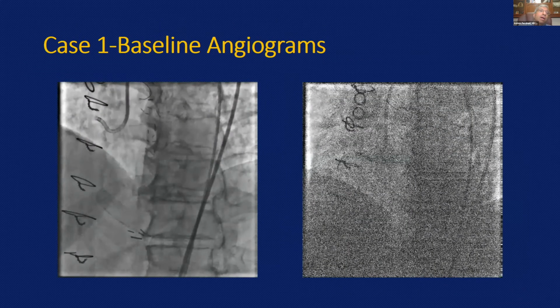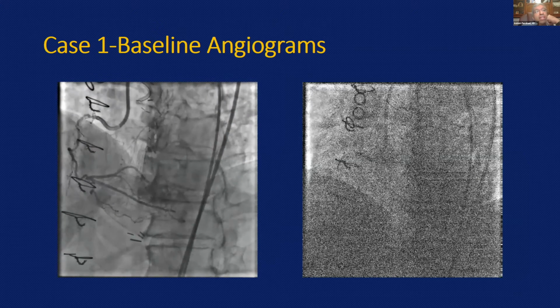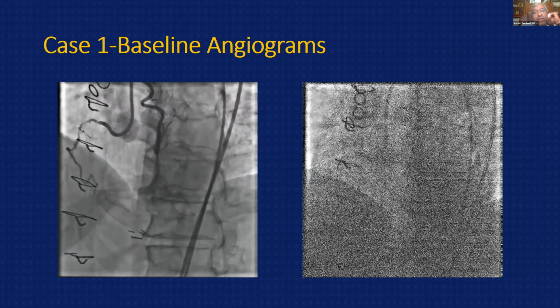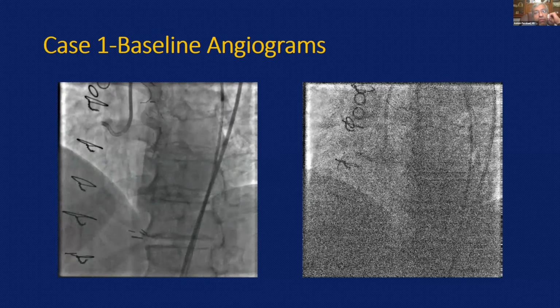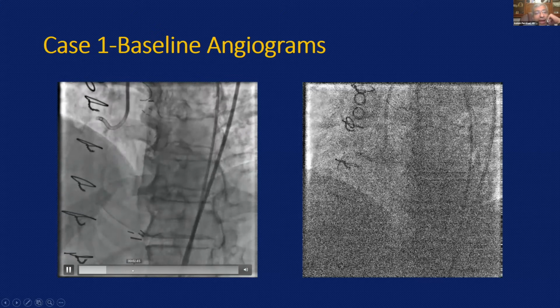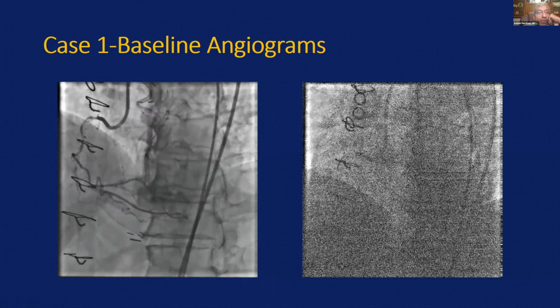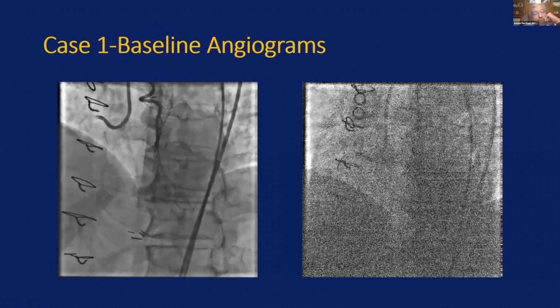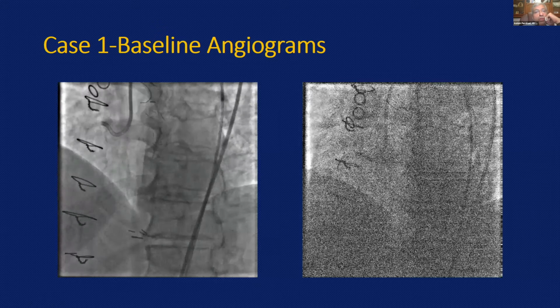So with that background of information, let's look at this angiogram. On the left panel, you can see a diffusely diseased right coronary in a patient who's had previous CABG, with predominant filling of the distal vessel through collaterals from the LIMA and an excellent distal target, but a lesion length that clearly is in excess of 20 millimeters in a vessel that's moderately calcified and on an angle right after that takeoff of the RV marginal.